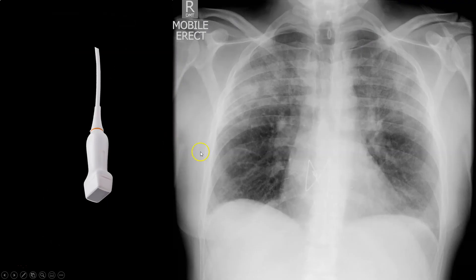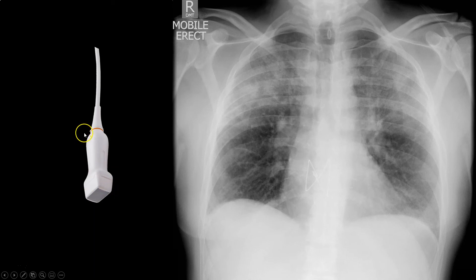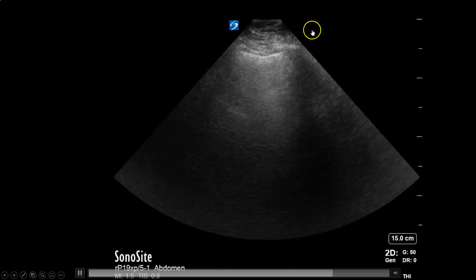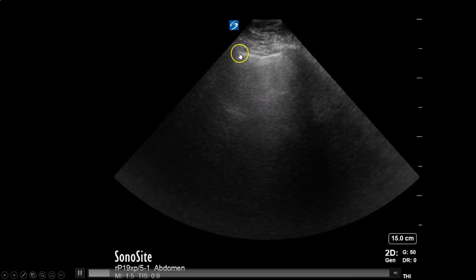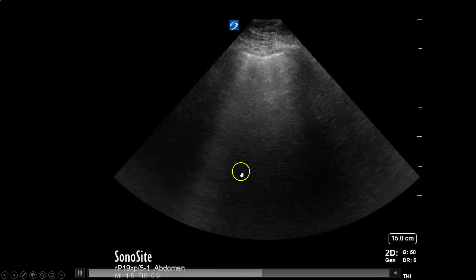Third, we're looking for pulmonary edema — you'd see diffuse opacities in the periphery and areas of pulmonary vascular congestion on X-ray. A lot of folks like to use the phased array probe for this, which is a lower-frequency probe with a unique square footprint, primarily used for echocardiography. My preference is to use the curvilinear probe for this indication as well, but some critical care colleagues prefer the phased array. On the phased array image, you have skin, soft tissue, and then the pleura. A bright white shadow that starts at the pleura and extends all the way down is called a B-line — we'll talk about that more to follow.